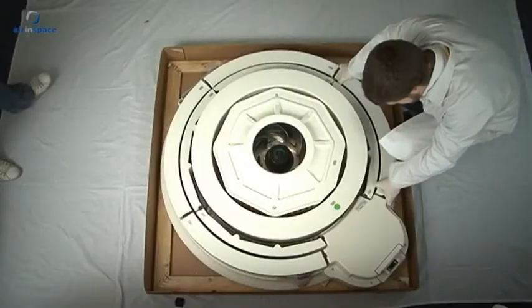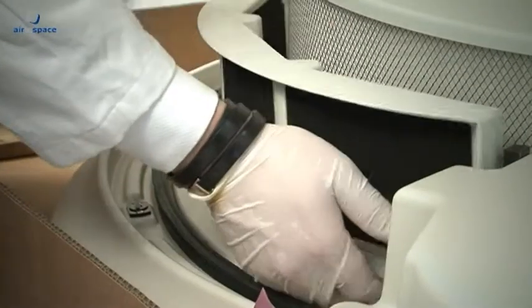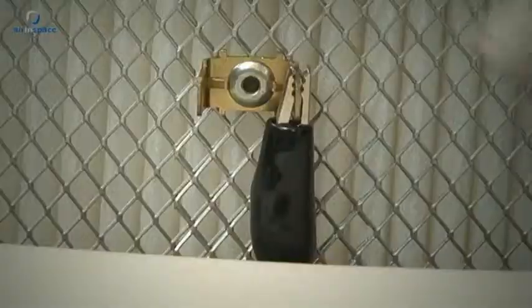Before the unit can be installed, its plastic cover, reactor modules and ventilator must be dismantled. The device's plastic base can then be mounted onto its support plate.